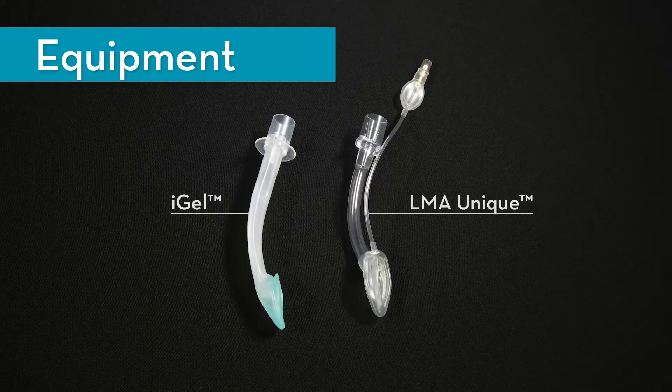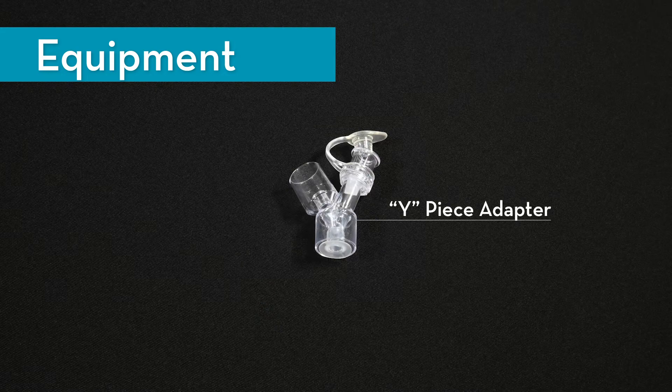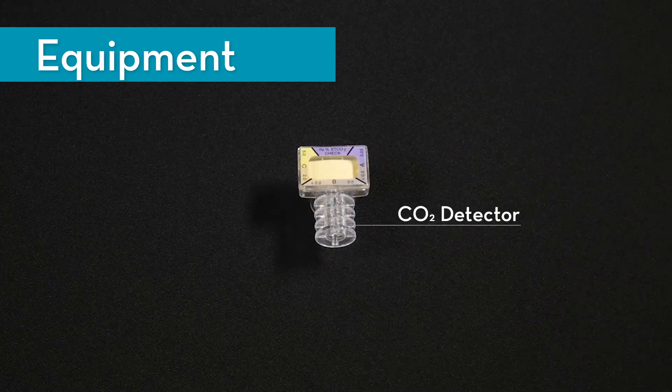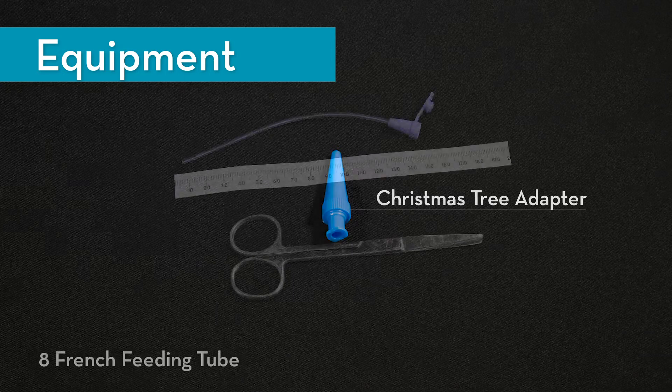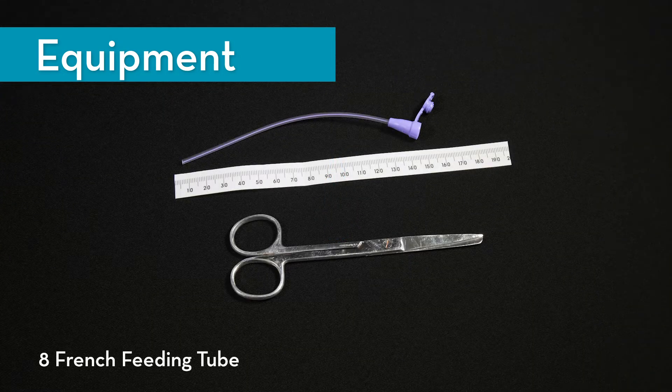Equipment needed for the procedure includes: an LMA — shown here are the iGel and LMA Unique, however there are several other LMAs available, and this video does not endorse any certain product — a Y-piece adapter, a CO2 detector, a Christmas tree adapter, and an 8 French feeding tube pre-cut to 14 cm in length.